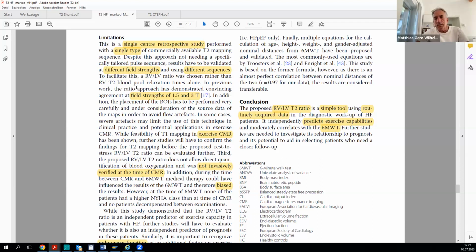So the discussion about which axis to use, I would tend more to be the short axis guy because I'm always looking at short axis mapping. Moritz found it easier to look at the long axis, and for the numbers, it doesn't matter. Yeah. I'm also more of a long axis guy because I think it's an advantage to see the valves and to see the context, including the atria.